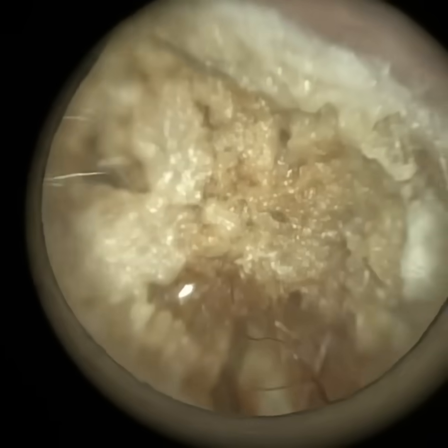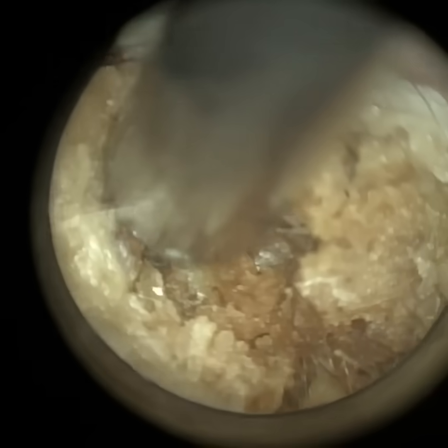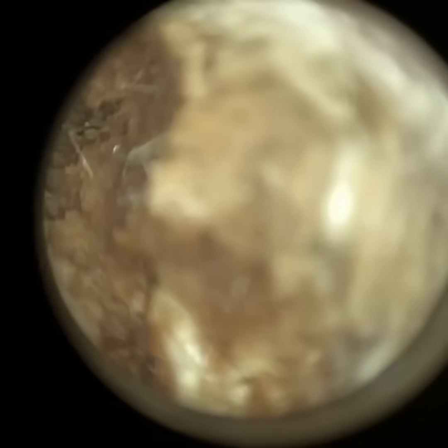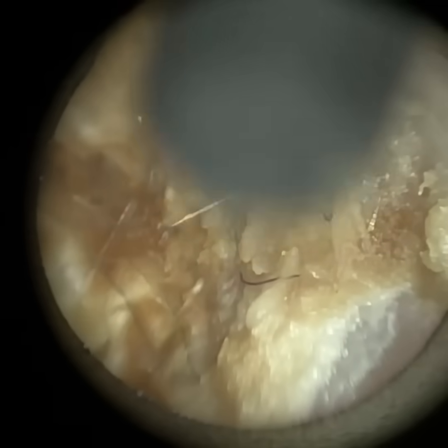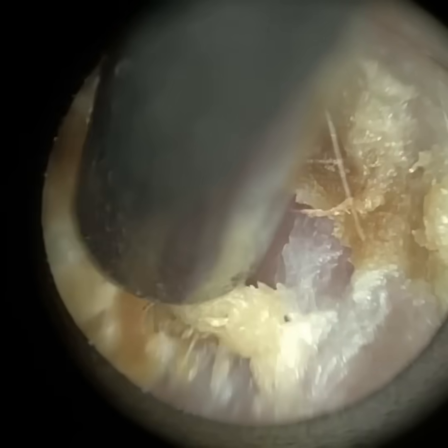There's no purulent discharge as such, which is more common with a bacterial infection, so it may well just be fungal. This patient will need to see the GP. I have recommended they use some Ear Calm in the meantime, which will help re-acidify the ear. All the water can increase the pH level, which typically then leads to swimmer's ear — a bacterial infection. But there's no pain here, so it's a tricky one to be fully sure about.